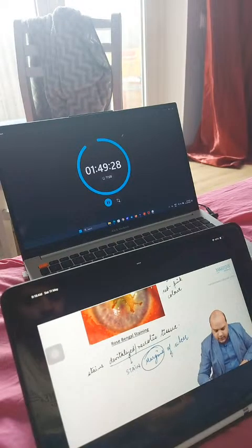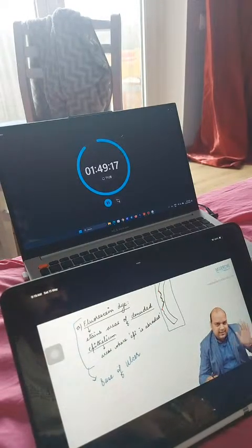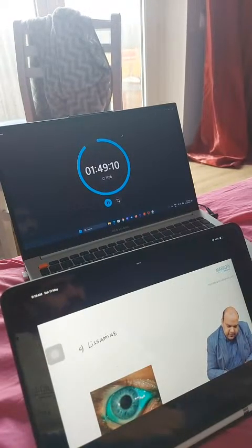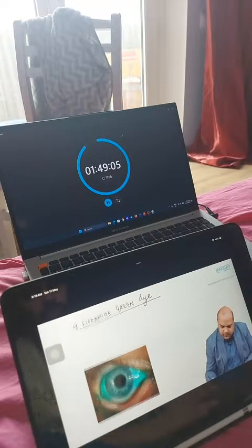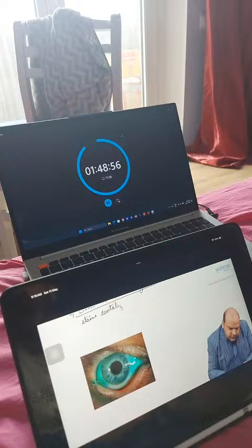Okay, everybody, that is what I had drawn if we see carefully in the image at the top. The base was stained by green color fluorescent dye, the margins were stained by red color, that is rose Bengal dye. So if we remember this image, we are basically able to remember the use of both these stains, that is fluorescein stain as well as rose Bengal dye stain. Done, everybody? Now, there is another dye which is used very commonly these days. I'm writing the name, you may have heard of it, you may have seen it. Lissamine green dye or stain. Okay? In terms of the ability to work, this is almost same as rose Bengal dye. Why? Because this also stains our devitalized and damaged tissue.